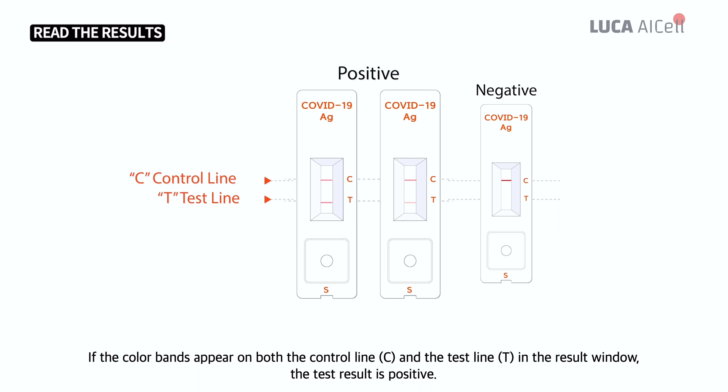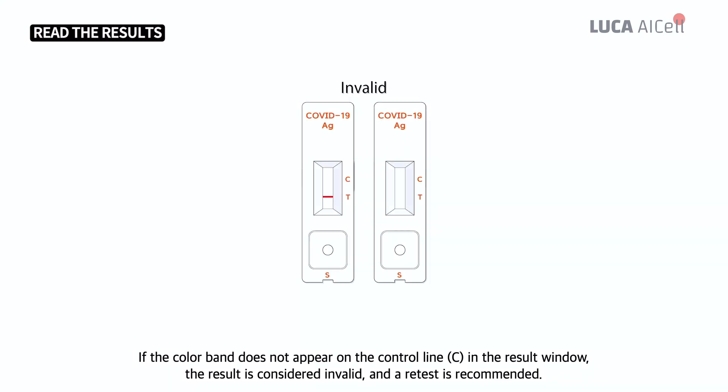If the colored bands appear on both the control line C and the test line T in the result window, the test result is positive. If the colored band does not appear on the control line C in the result window, the result is considered invalid and a retest is recommended.